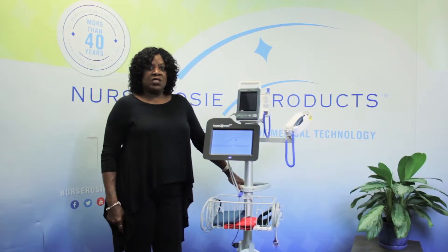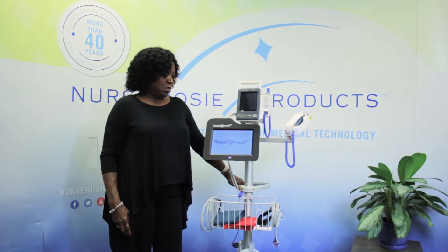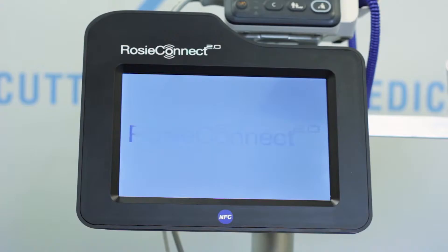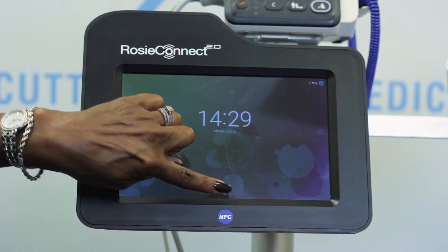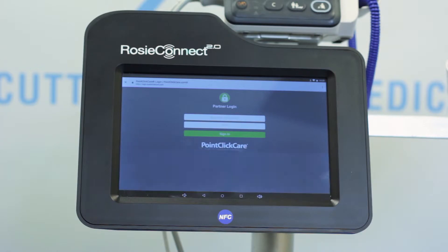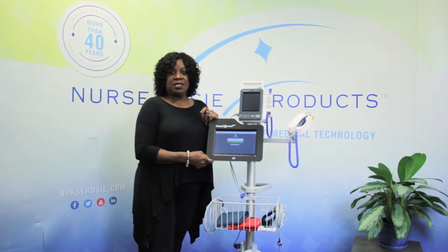The RosieConnect graphics on the screen signal that the tablet is going through the power setup sequence. It usually takes a minute or so. Once you see the time, immediately swipe up from the lock icon to unlock the screen. So as you can see, it's very easy to do. Now I want you to pause this video and turn on your RosieConnect tablet. See you in a minute.